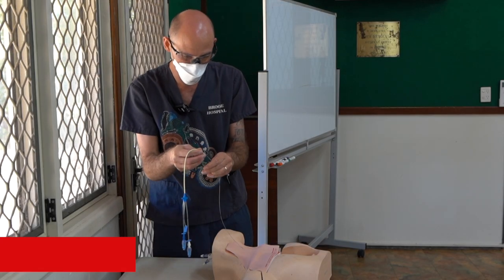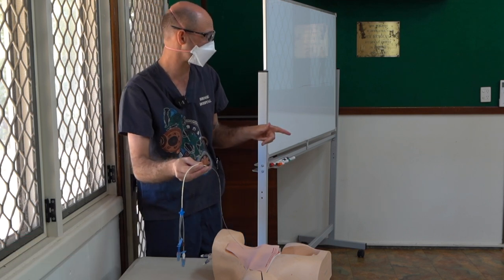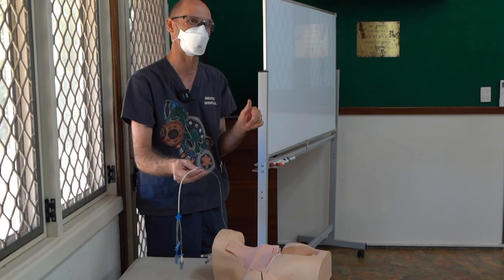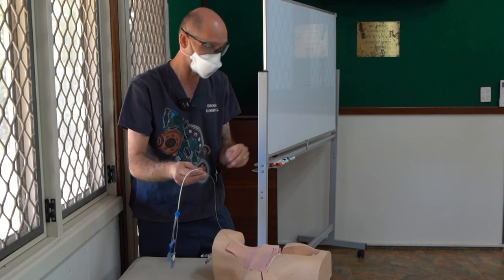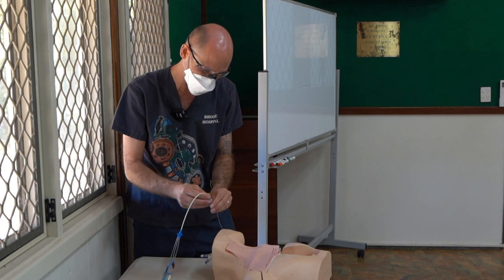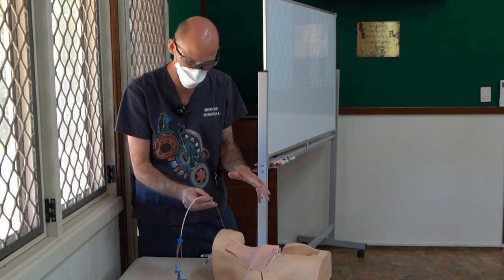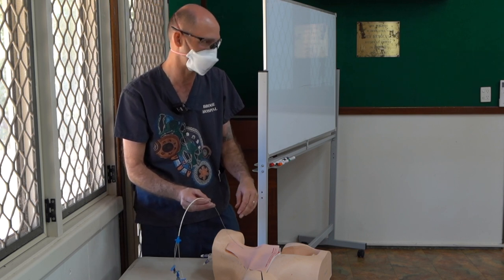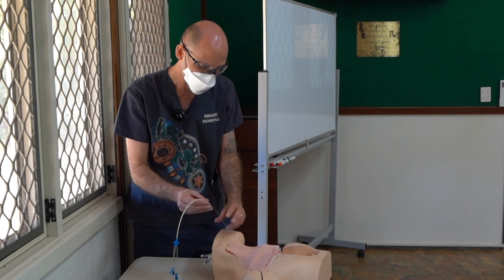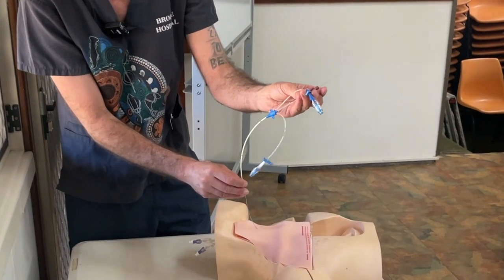Holding my wire — if I let go of my wire, does it get sucked down? It won't automatically get sucked in. But what will happen is as I'm pushing the catheter in, something distracts me and I realize I've lost my wire — and potentially I won't get it back, and I'll have to go to theatre to get that fixed. So hold my wire until it comes out the brown distal hole. Wire's coming out there.